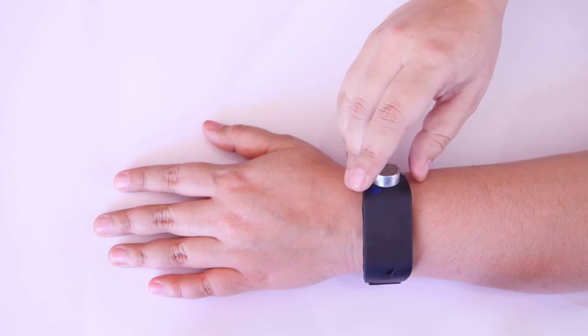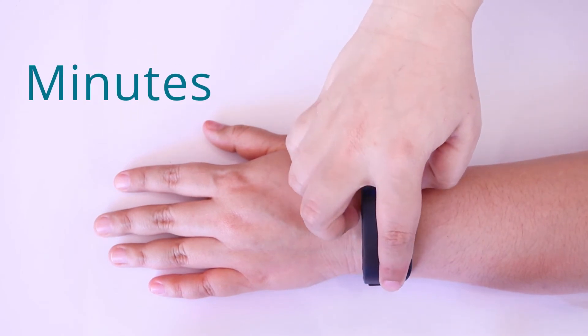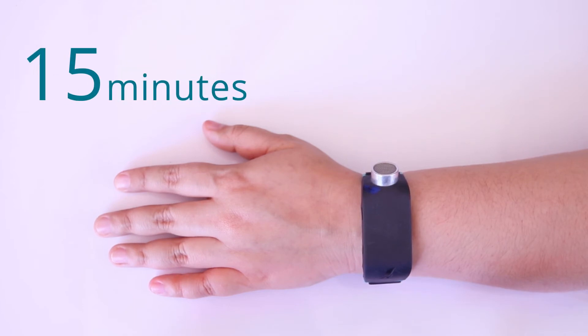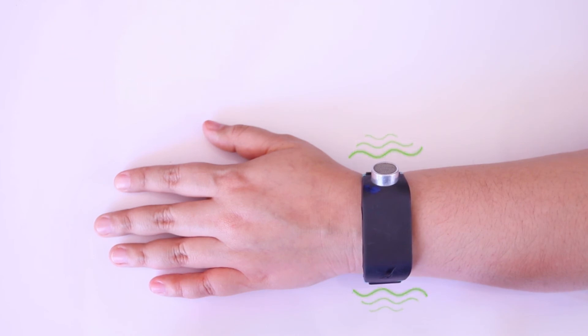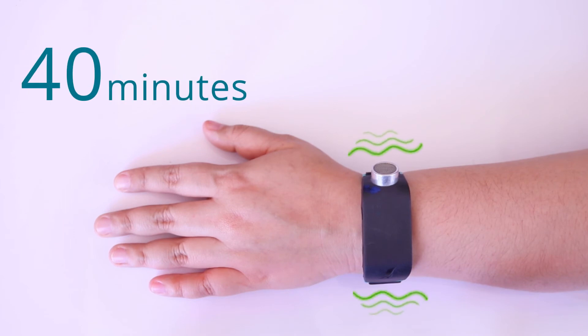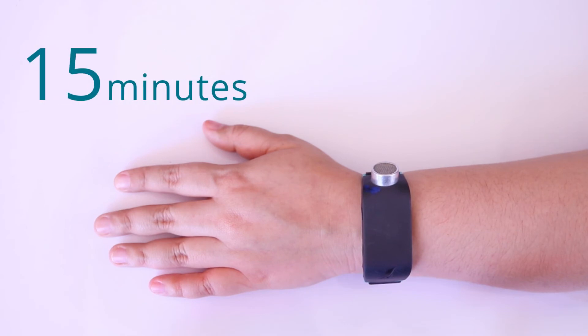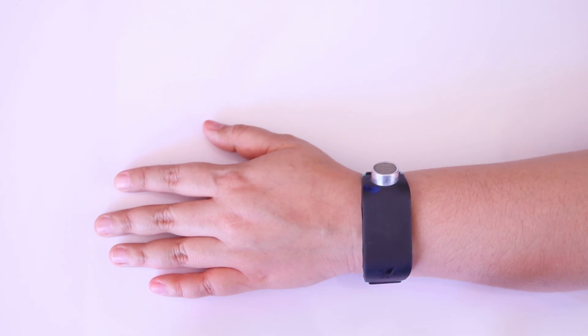Swipe out on the touchpad to read the minutes. The minutes are indicated in groups of vibratory patterns separated by a long pause. In the first group of pulses, Sonoban tells the time in 10-minute increments. A long pulse equals 50 minutes and a short pulse equals 10 minutes. For example, 4 short pulses in the first group equals 40 minutes. If you feel 1 long pulse, this equals 50 minutes. If there are no vibrations in the first group, you are less than 10 minutes past the hour.